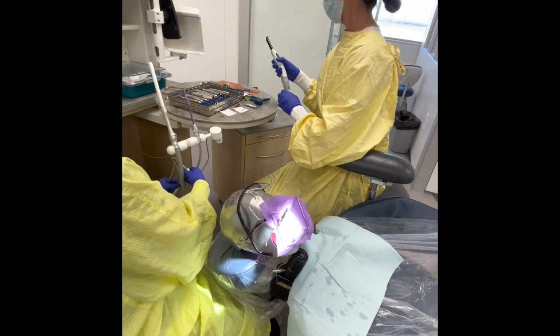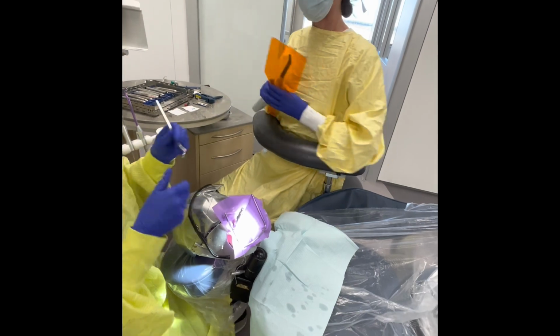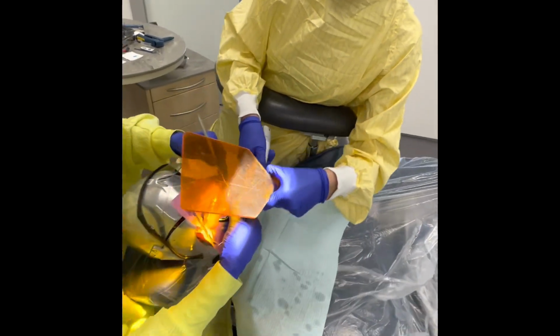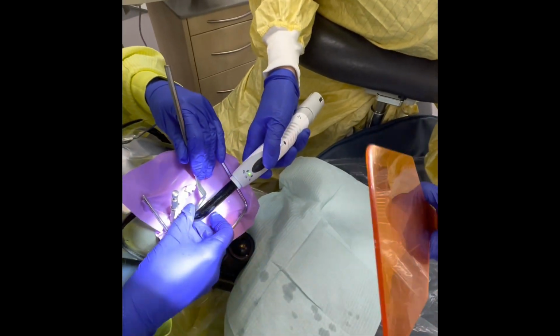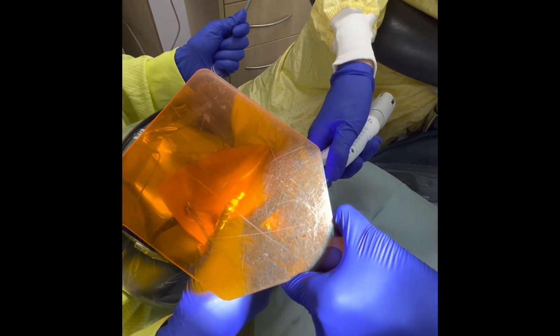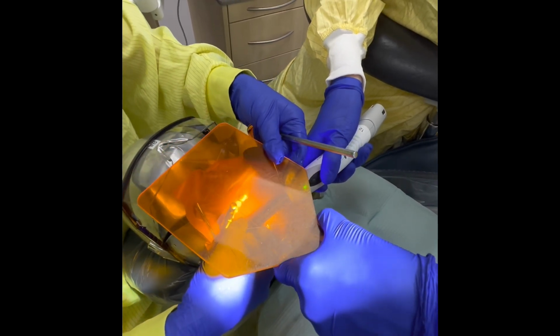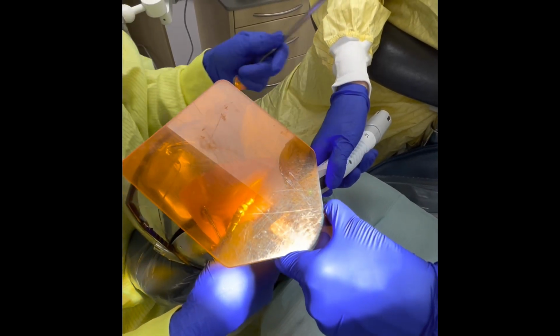And then a cure for 10 seconds. So I will have to reset this. Thank you. I will guide her light in to ensure that we are in the correct place. And we're going to cure for 10. And sometimes your operator may help secure this for you if we don't want it resting on their face. Right. Okay.